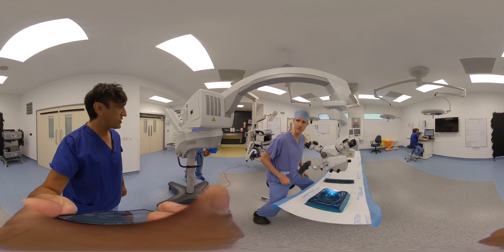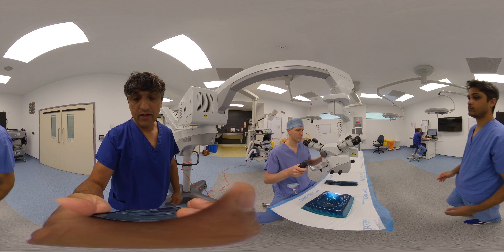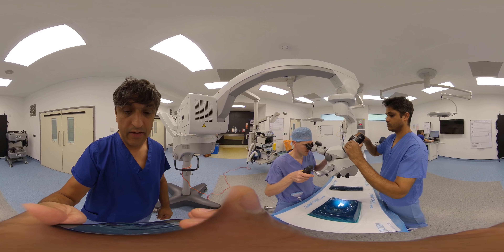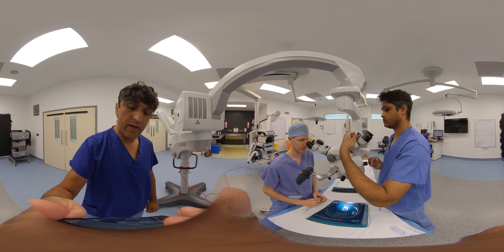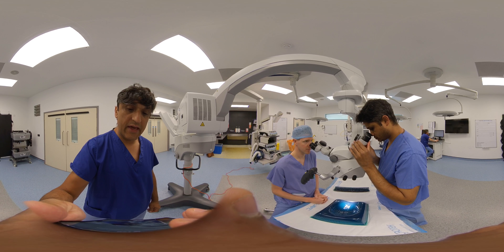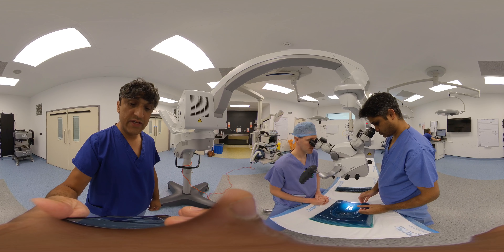There are two ways the assistant's position can be set up. Either standing, which Prakash is demonstrating here — it tends to be easier as an assistant to be standing rather than sitting because you're over the top of the patient. Get your eye in a nice comfortable position and shoulders nice and comfortable, and then you're set.